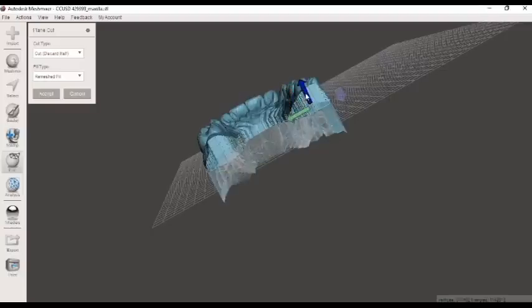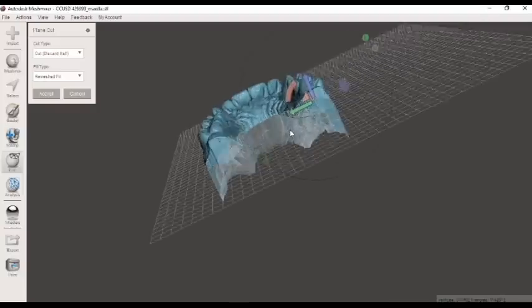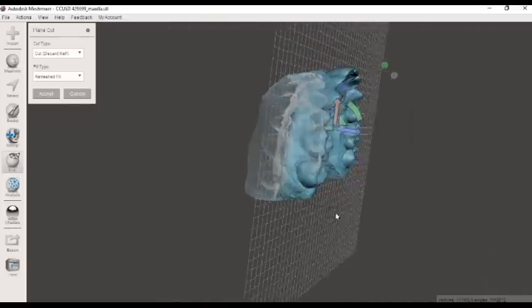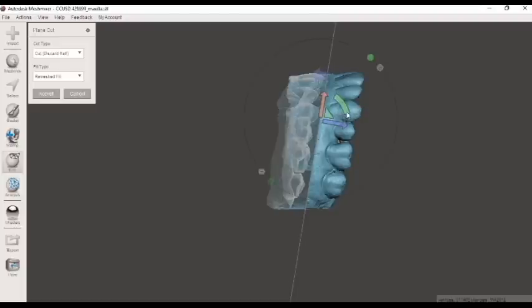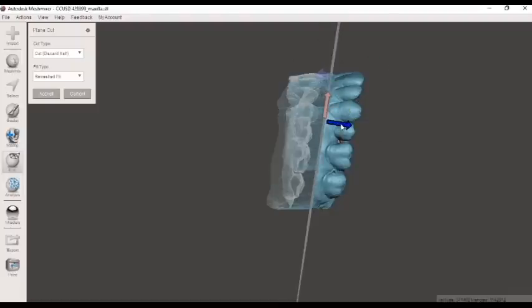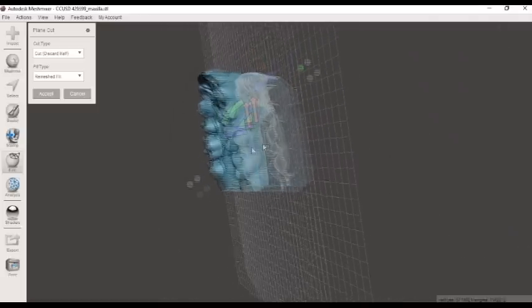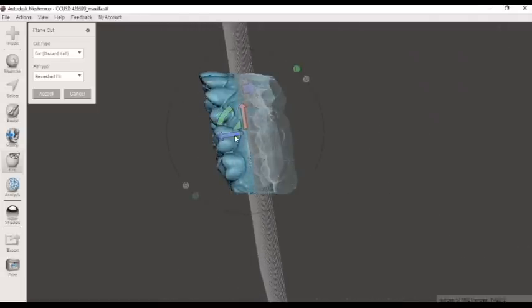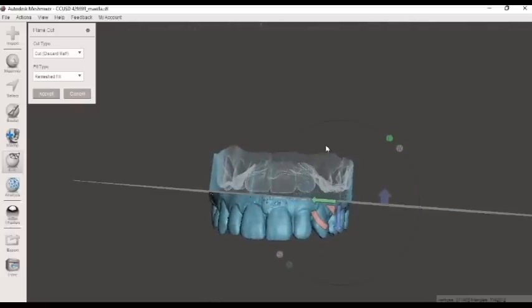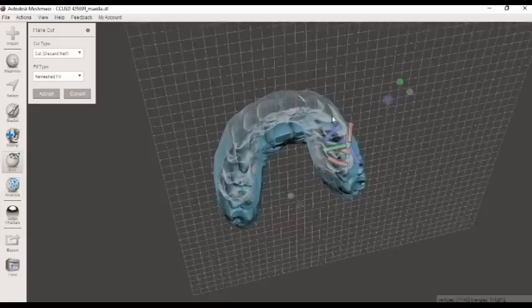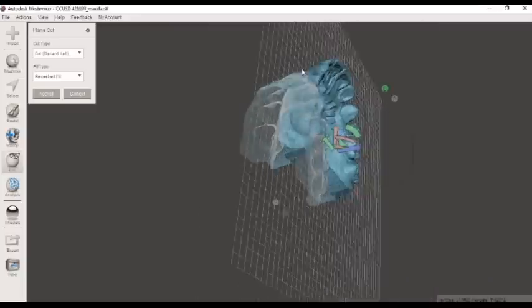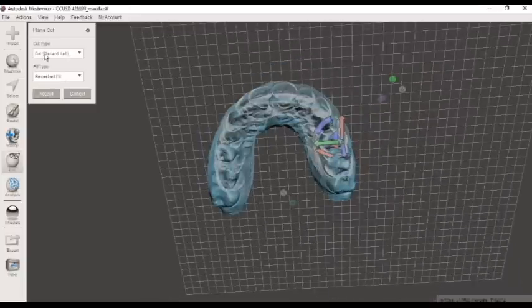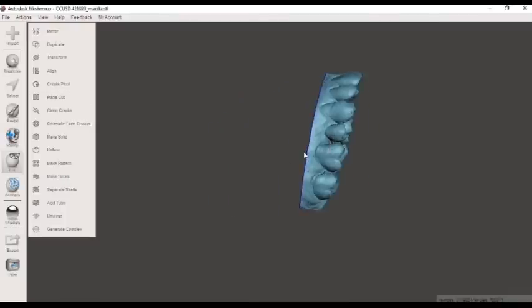You can make your base as tall or as short as you please. If you're in a really big hurry and you want this to print quickly, then don't put a big base on it. Okay, we got lots here. I'm just going to kind of bring this down. This is just kind of how I like to edit them. Okay, once you have it how you like it, you can come over here and choose accept. Awesome.